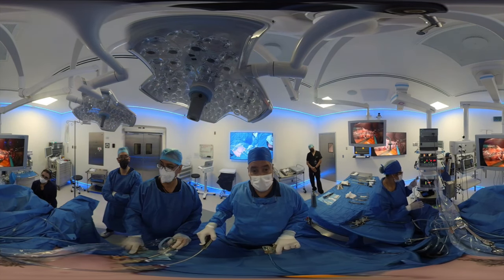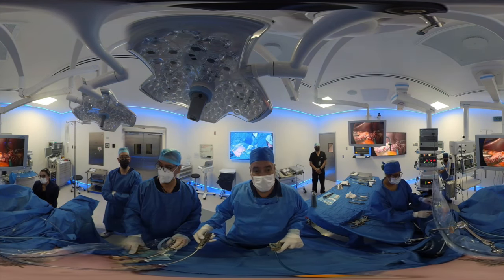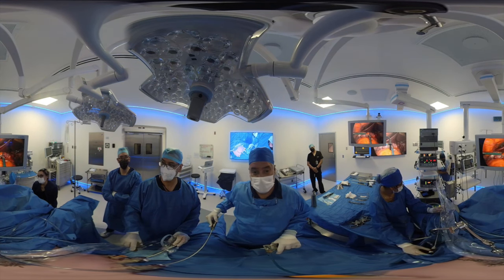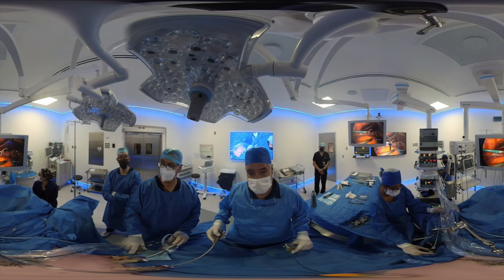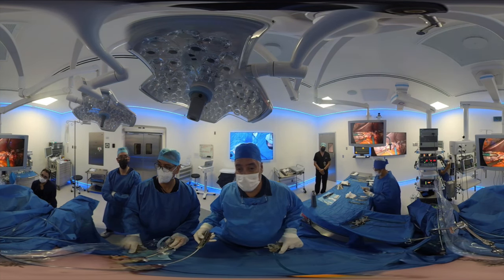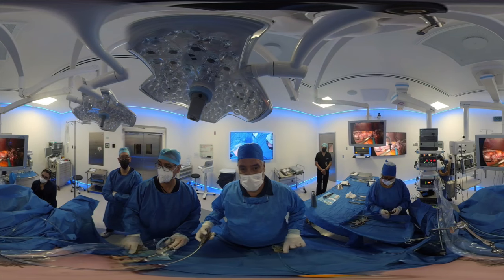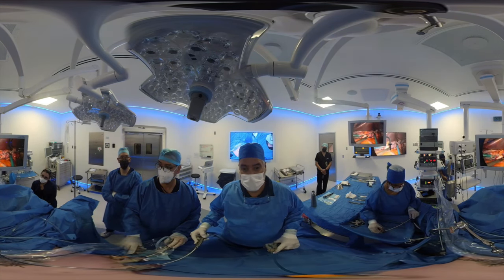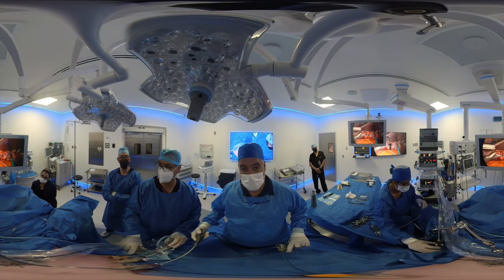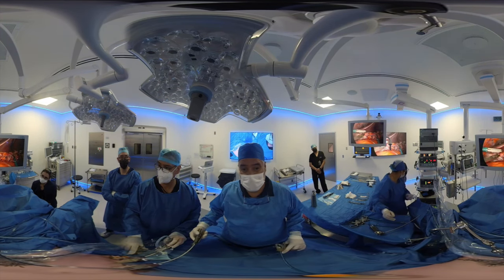This procedure is done minimally invasive. The patient will go back to the recovery room in around 10-15 minutes as soon as we finish, then recover for around 30 minutes before being passed back to the room. Usually these patients are walking around a couple of hours after the surgical procedure. All in all, the patient has been hospitalized for less than half a day, had surgery, and will be discharged in less than 24 hours. Patients always tell me: why didn't I do this sooner? That's the only regret, because of the dramatic weight loss and wellness that follows.